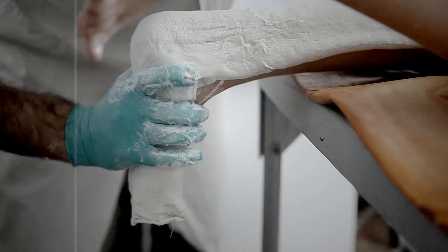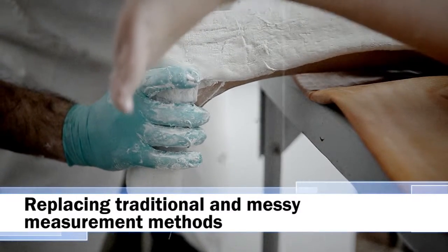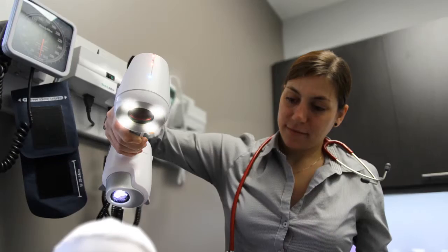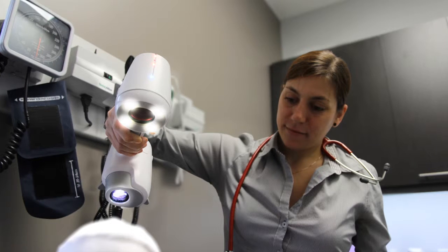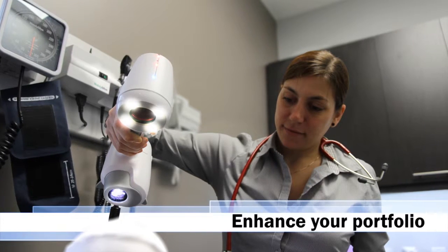3D scanning technology is useful to reduce turnaround times by replacing or skipping steps in traditional and messy measurement methods, like plaster casting. We strongly believe that our cutting-edge 3D scanning technology can help you enhance your portfolio of products and services.